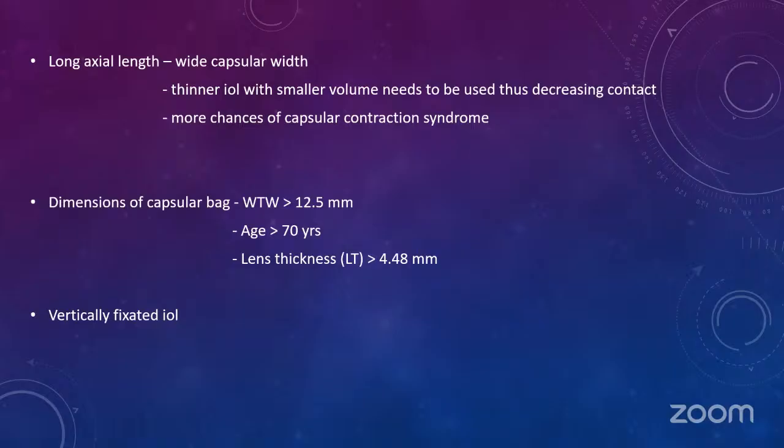The main purpose of the entire study, or of the entire effort for the IOL to not rotate, is just to make sure that the IOL and capsule stay in adequate contact with each other, so that the IOL does not rotate.